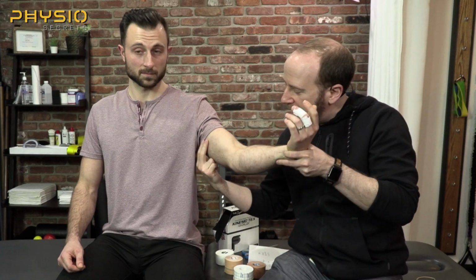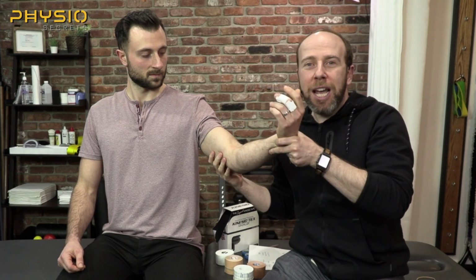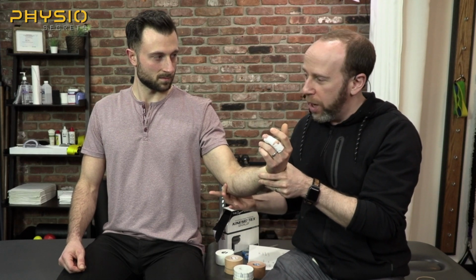If I took that exact same piece of tape and I accidentally applied it posterior to the joint line just a little bit, the exact opposite phenomenon occurs. When I extend the arm, the tape's going to go on slack, and when I flex the elbow, the tape's going to go on stretch. So you have to be very mindful, particularly with hinge joints like the elbow, the knee, the ankle, when you apply the tape, whether you're applying the tape anterior or posterior to the joint line will determine whether the tape is on stretch or slack, depending upon whether they're in extension or flexion.